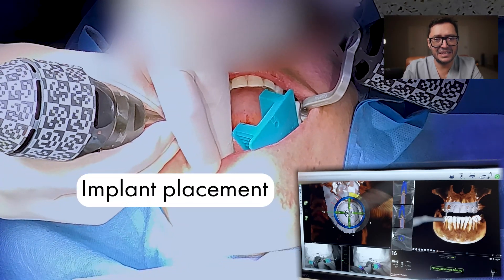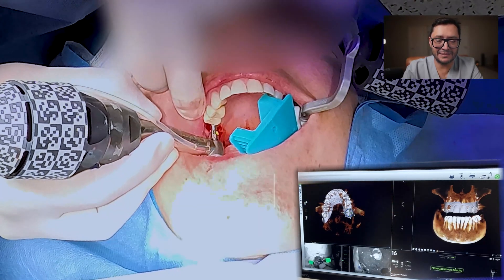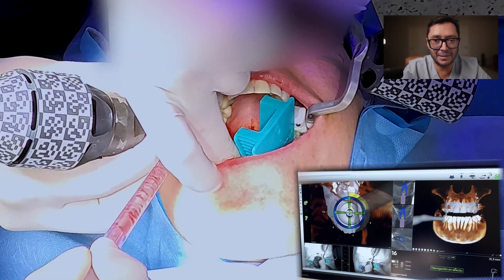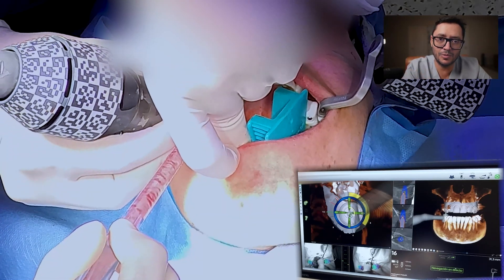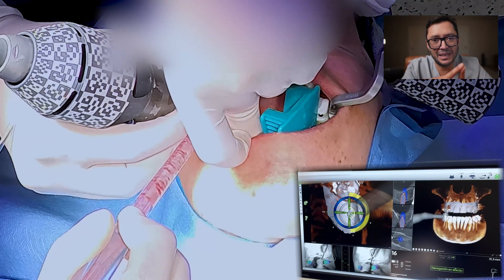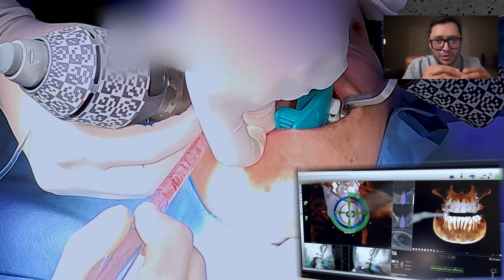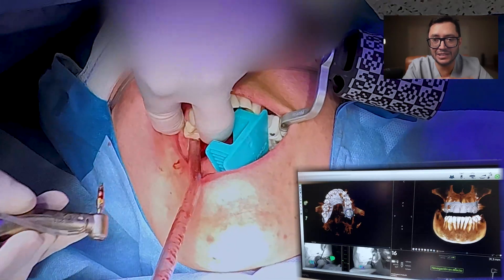In this case, we wanted to place the implant using also the X-Guide. You really don't have to, because if you have done the proper drilling protocol, the implant will go by itself. But in this case, I wanted to check how it went according to plan and make sure it's going to be at the proper depth relative to the maxillary sinus. I wanted to go between one and two millimeters into the sinus for this implant, and this I could check, as you can see on the screen.